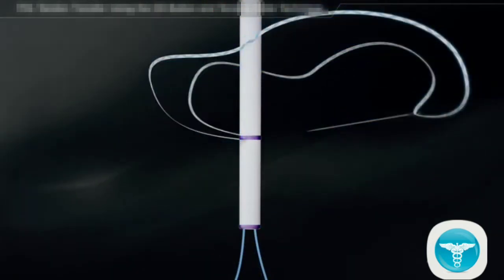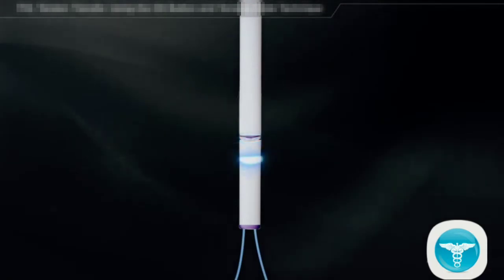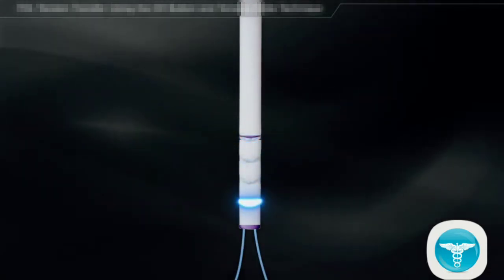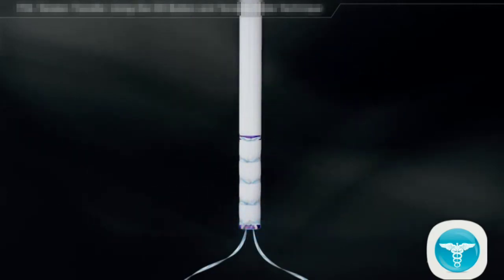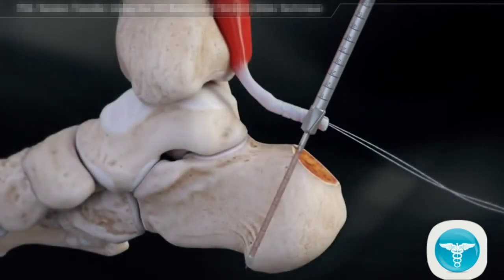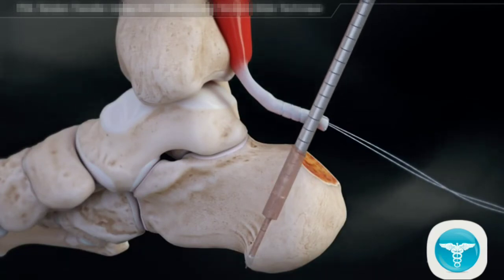Speed whip stitch with the fiber loop suture tape and lock the construct by making the final pass proximal to the previous pass and having the needle exit through the distal tip of the tendon. Use the reamer in the implant system. Drill either 20 or 30 mm based on screw length.